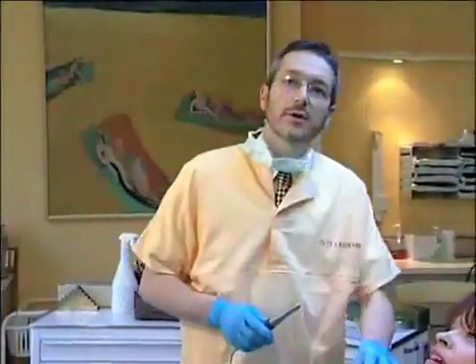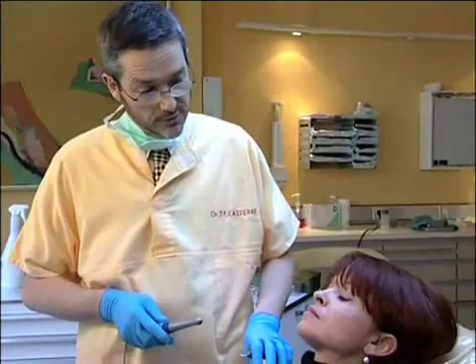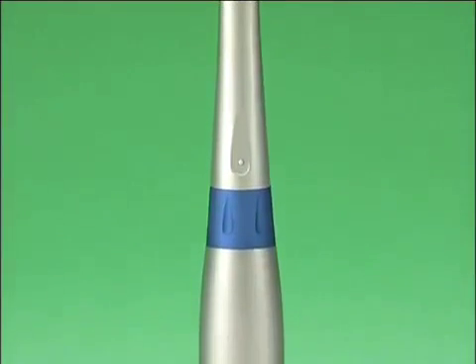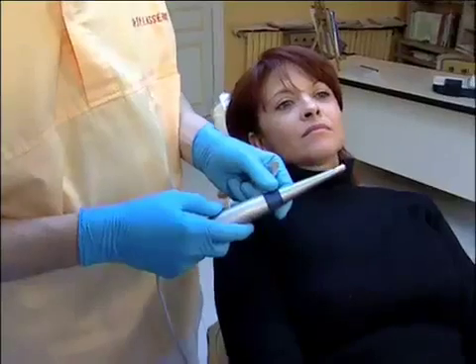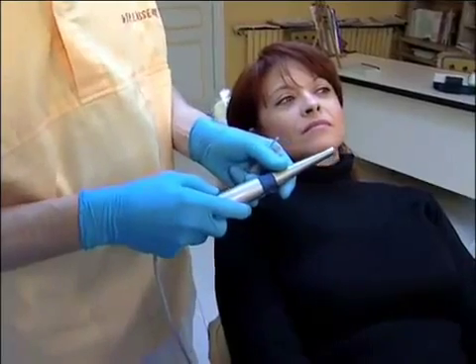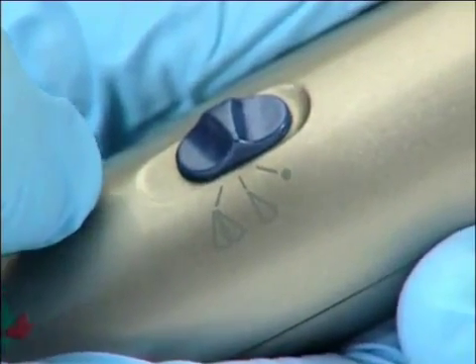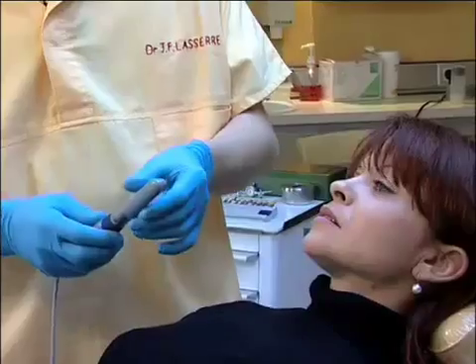We are going to show on this patient the different steps of the selection of the base color for a tooth. In this instance, central incisor number 21, using the Sopro 717 camera's Sopro shade function. The Sopro Shade 1 button is set to intermediate position, and the tip designed for shade selection, the Sopro shade tip, is placed on the camera head.